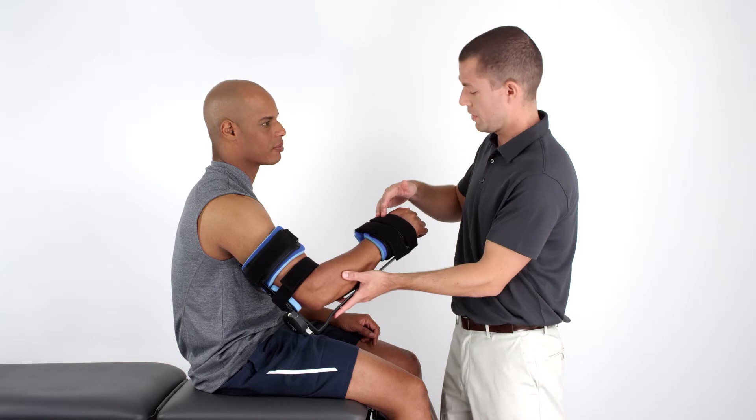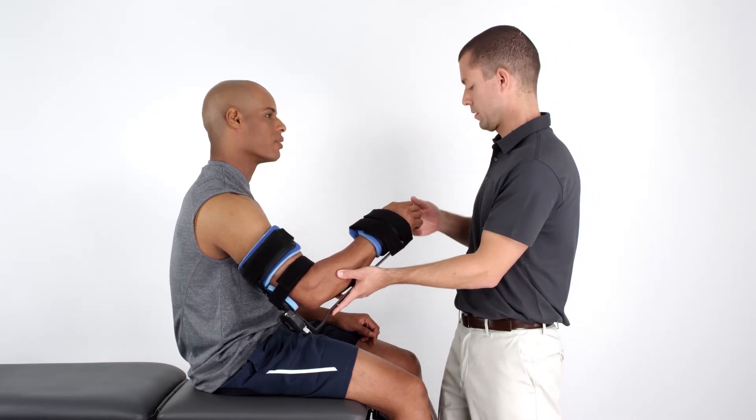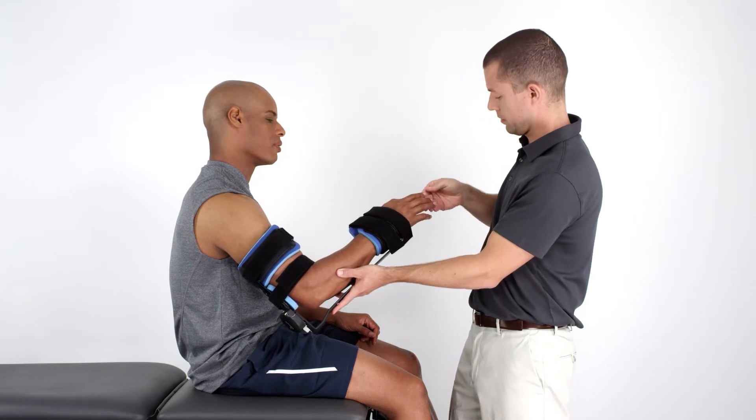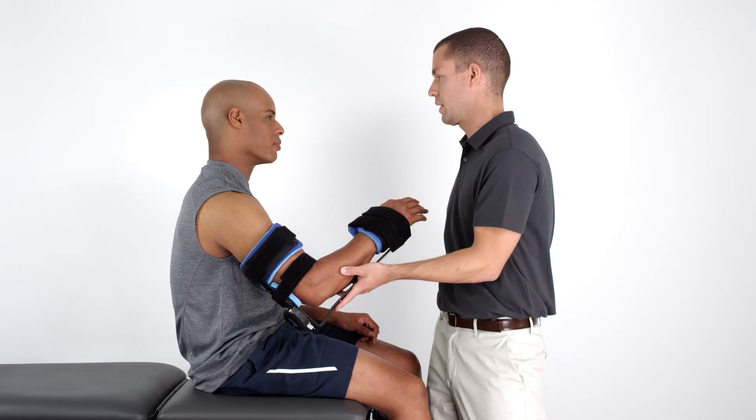When the device is secure and the patient is comfortable, check for any neurological or vascular changes. The patient should not experience any numbness or tingling while wearing the orthosis.